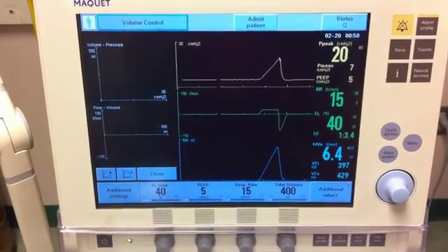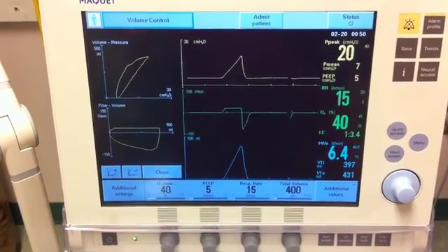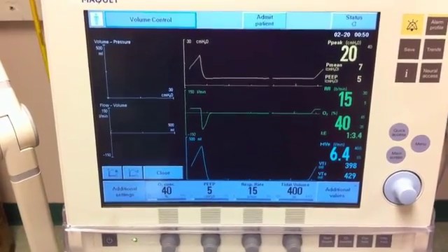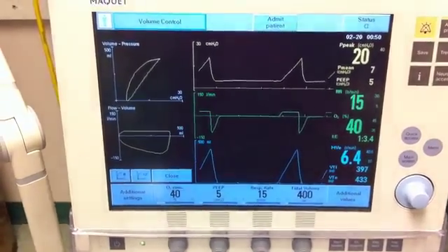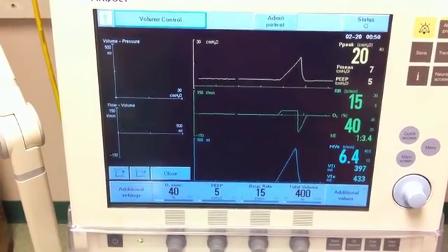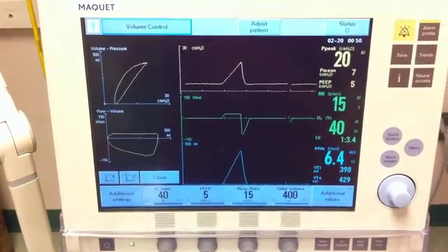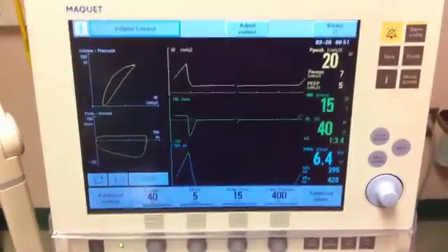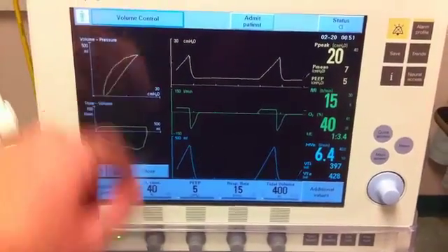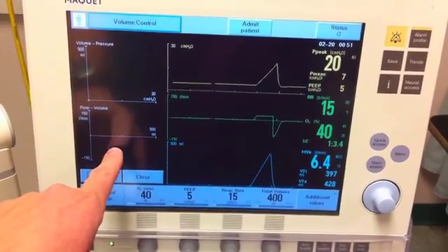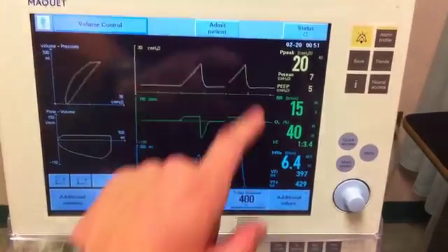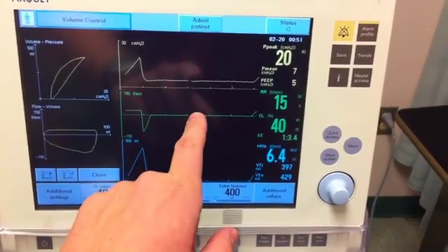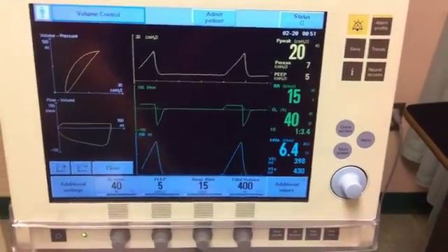You notice no spontaneous breaths at this time, and you can see the following graphics. Take a minute to discuss the findings of the graphics and see if you note any deficiencies or problems based solely on a graphic analysis. For quick familiarization, you have your volume-pressure loop, your flow-volume loop, your pressure-time waveform, your flow-time waveform, and your volume-time waveform.